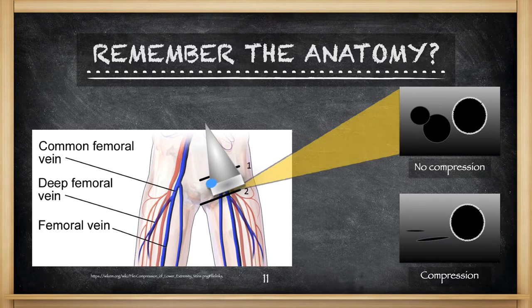The next spot you're going to find is the sapheno-femoral junction. This is an area of turbulence and can be quite concerning for the development of a DVT, so it's really important to not only visualize this portion but provide some compression on it as well. On the top image you see the artery, the deep femoral vein, and the sapheno-femoral junction, and then you see the compression on the bottom.